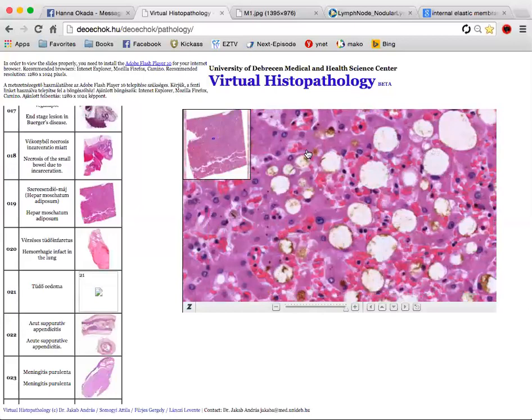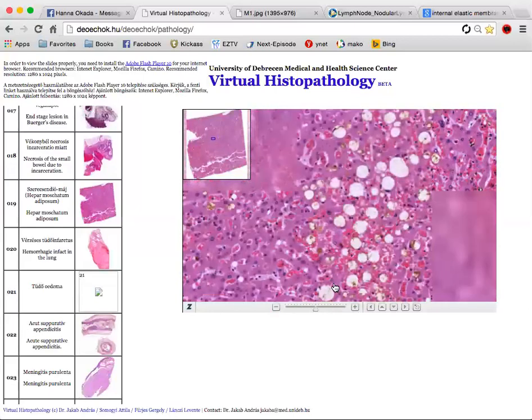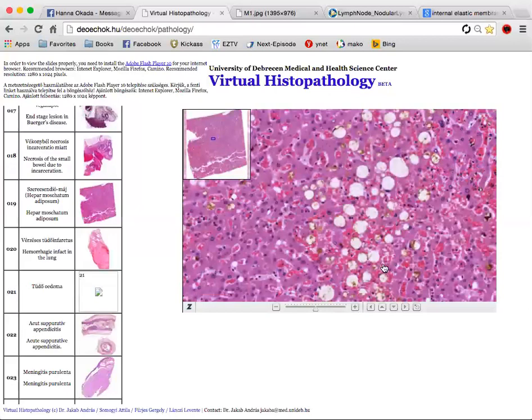Like, we have hepatocytes, and around the central vein they cannot really get the oxygen from the triad. So we can see the aggregation of adipocytes here, and this is more central or more peripheral of the hepatocyte. But these aren't adipocytes.